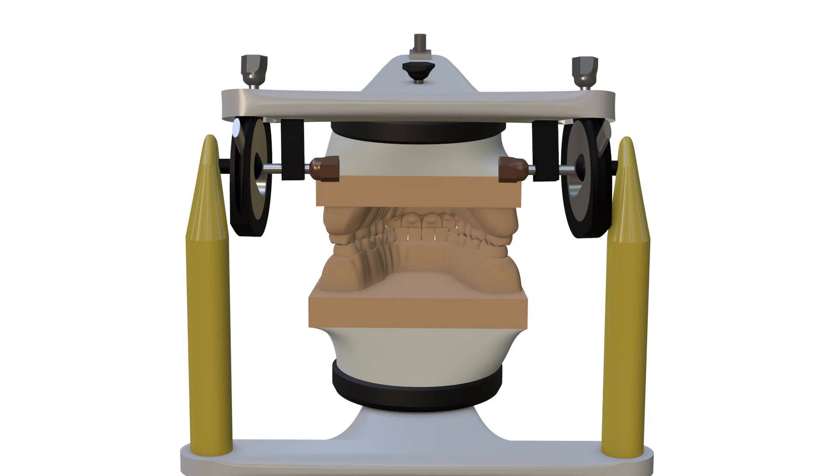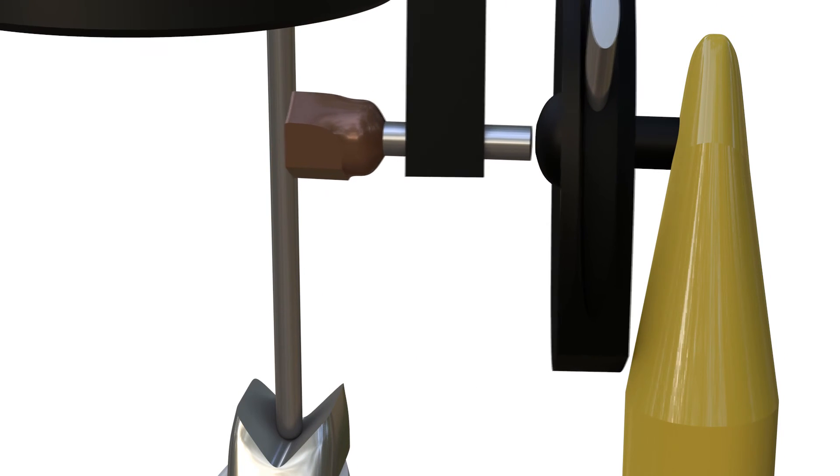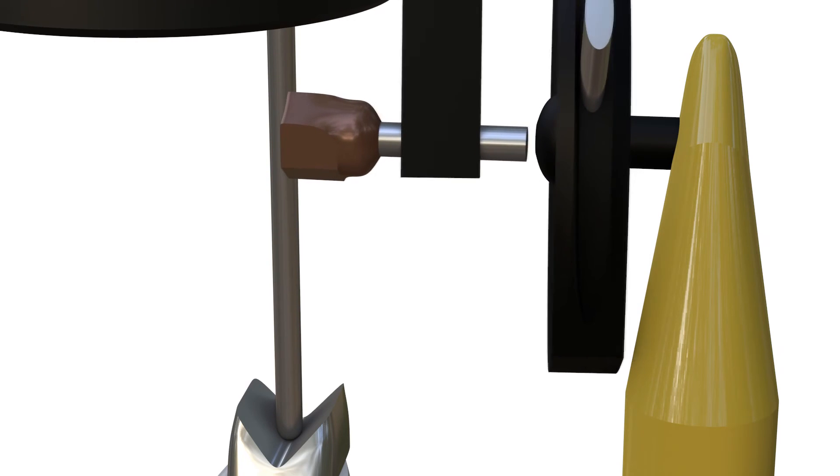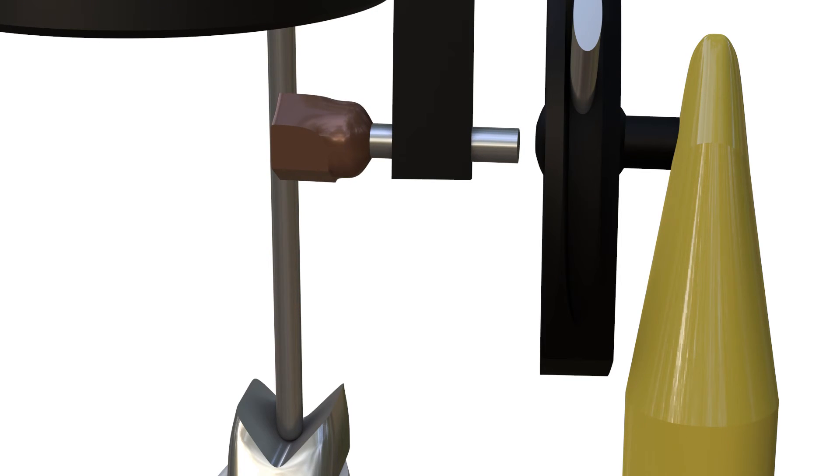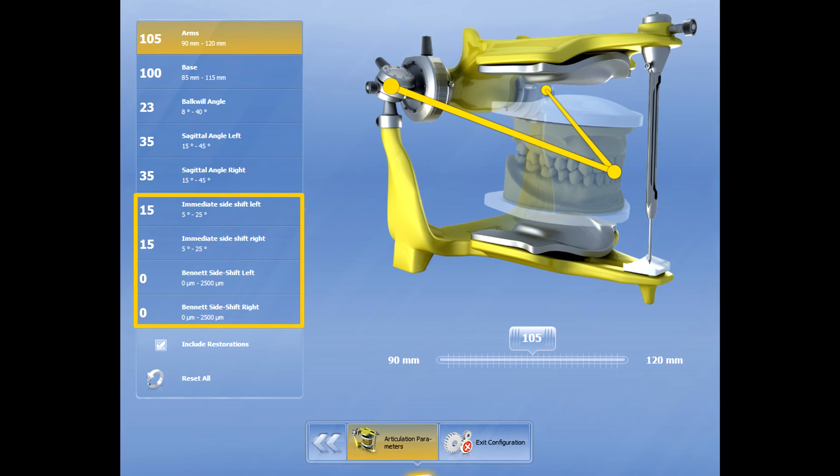In articulators that mimic this movement, right and left relieving screws are present. These screws should be relieved 0.5 millimeter to reach a total of 1 millimeter relief. For digital articulators, it is sufficient to enter the desired value.